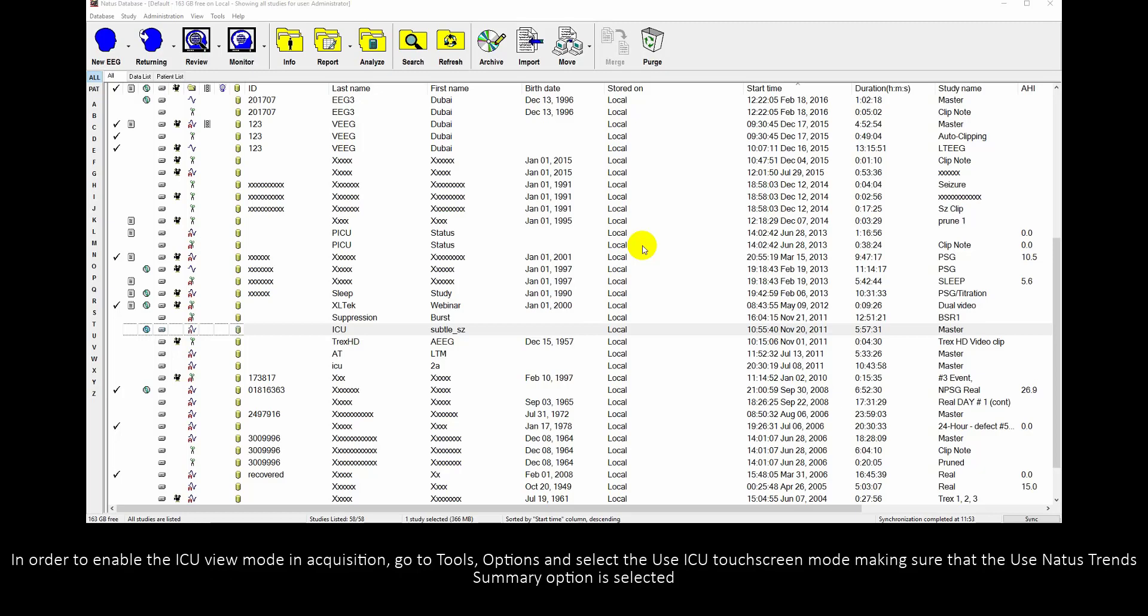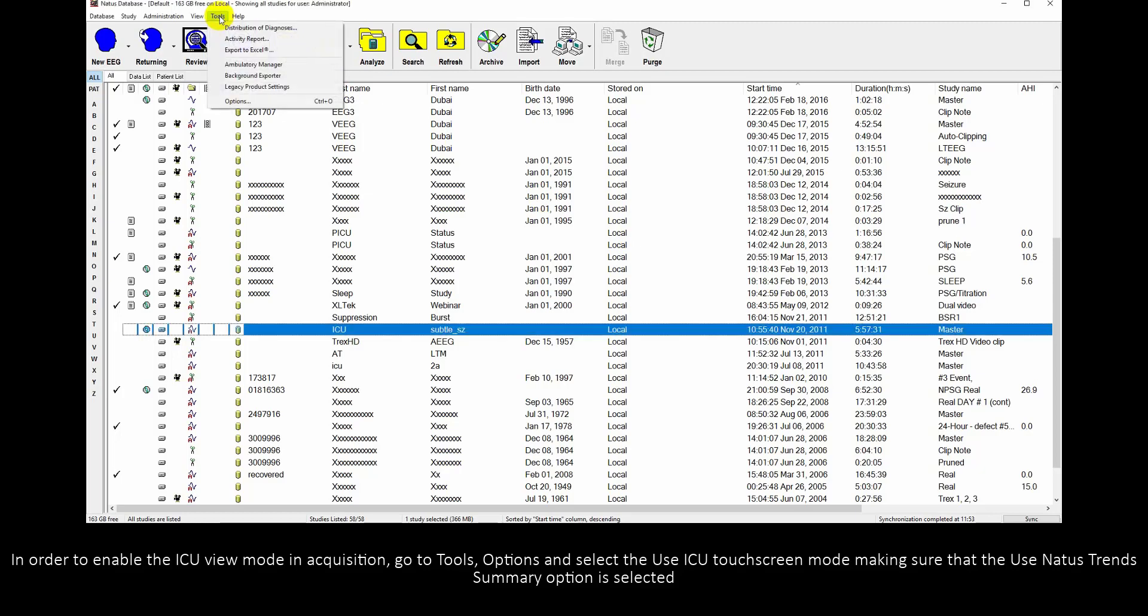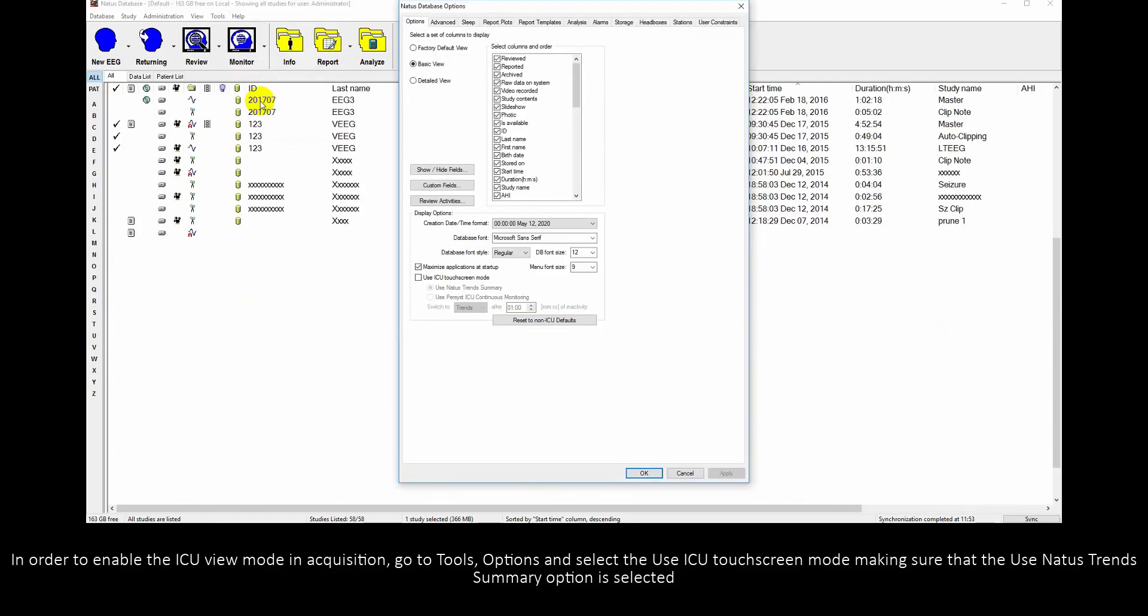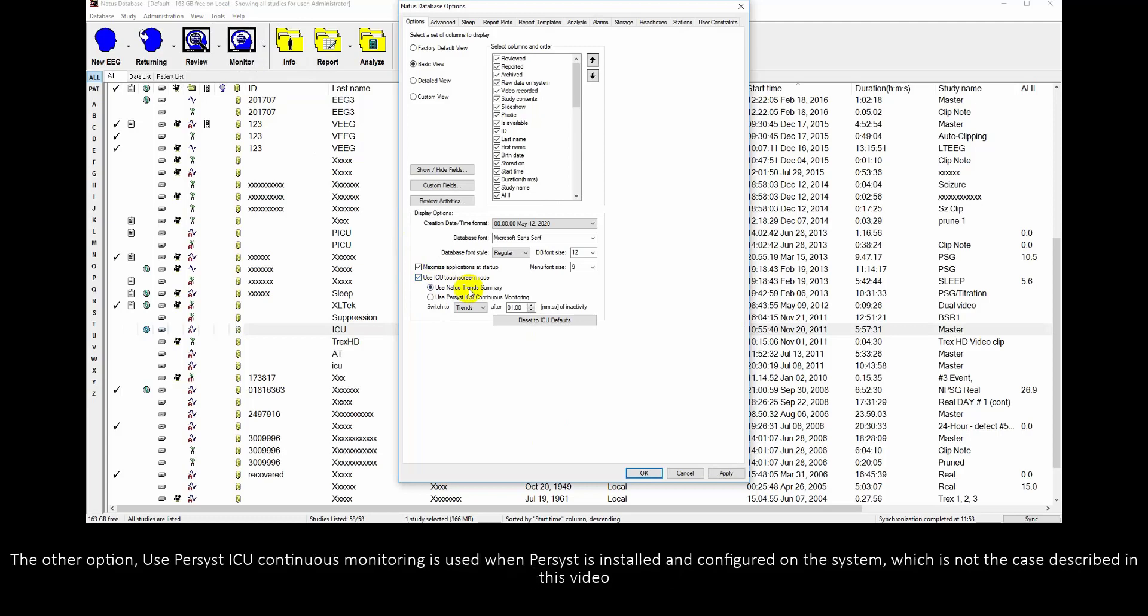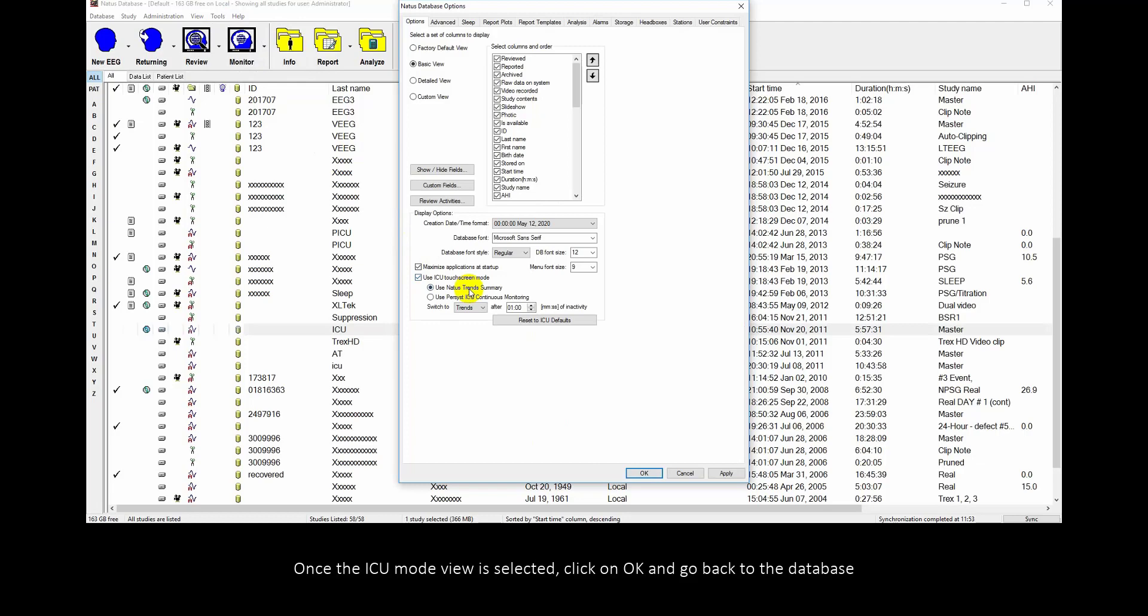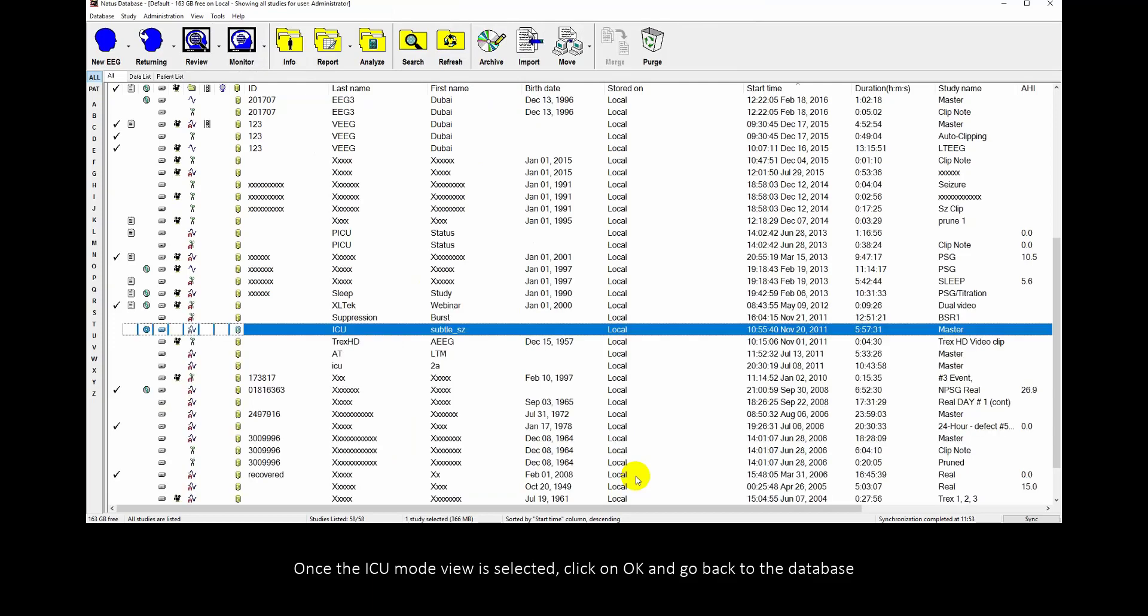In order to enable the ICU View Mode in Acquisition, go to Tools, Options and select the Use ICU Touchscreen Mode making sure that the Use Natus Trends Summary option is selected. The other option, Use Persyst ICU Continuous Monitoring, is used when Persyst is installed and configured on the system, which is not the case described in this video. Once the ICU Mode View is selected, click on OK and go back to the database.